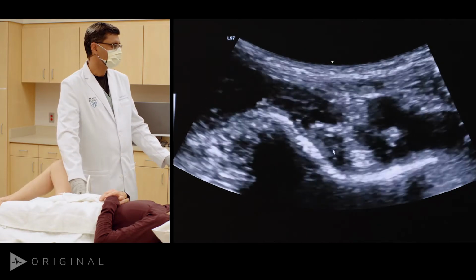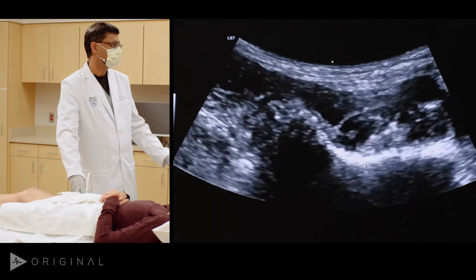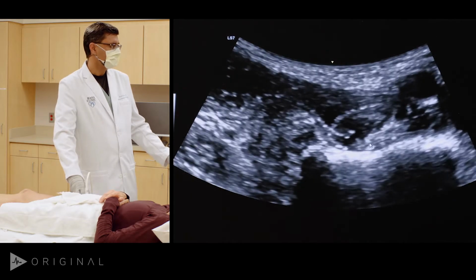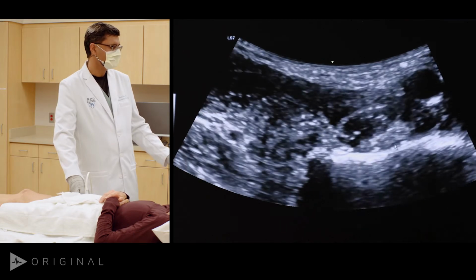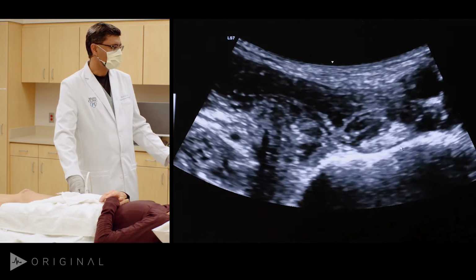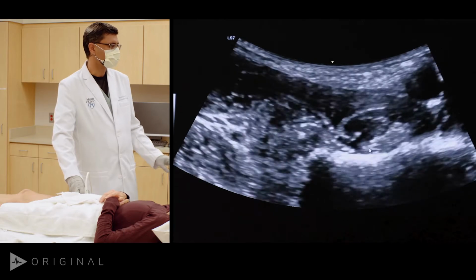You can see the muscle going up. Tendon stays there. And we straighten again, and the tendon has stayed exactly there. If this was an abnormal case, this muscle would have come under the tendon, insinuating itself between the tendon and the acetabulum. And then in the final position of the limb, it will pop back out, and that's what causes the snap.